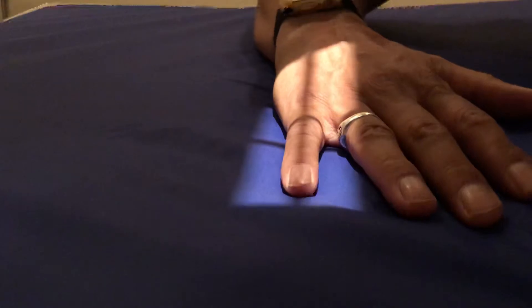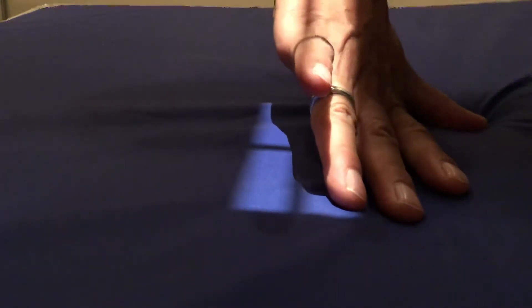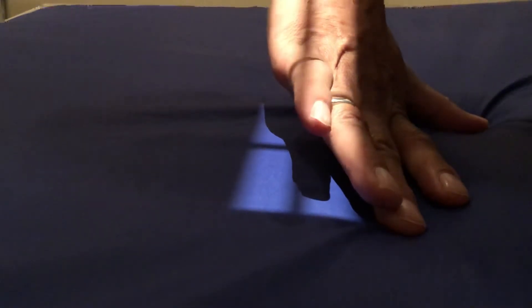For the oblique, what you're going to do is raise the hand up about 45 degrees, and you want to make sure that the other fingers are not superimposed as best as possible. That will be the first oblique. The second one is going to be 45 degrees the other way, and again, you want to keep the fingers out of the way if you can. So that's the second one.